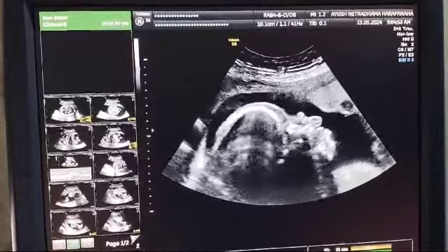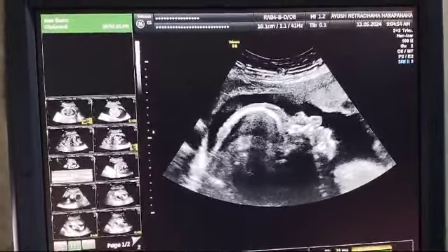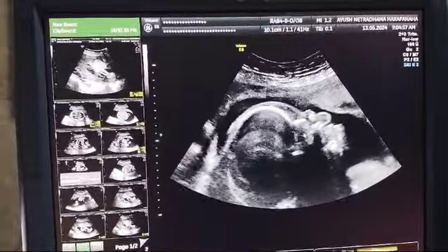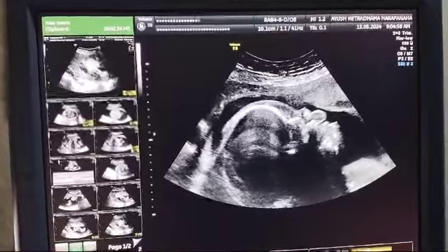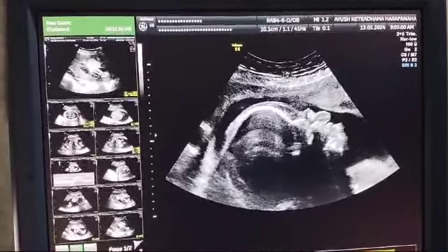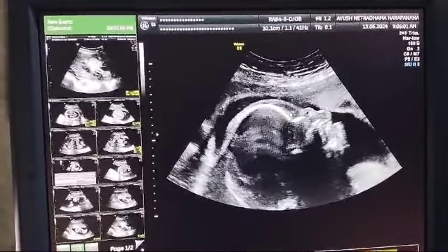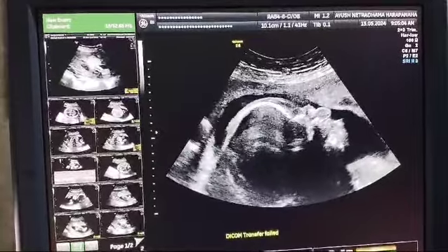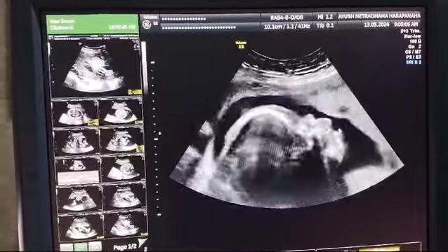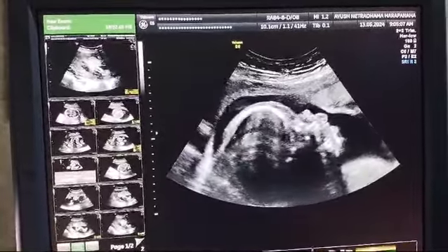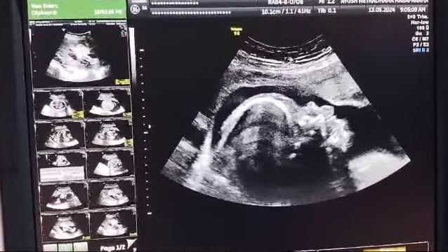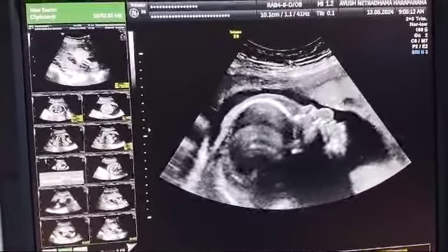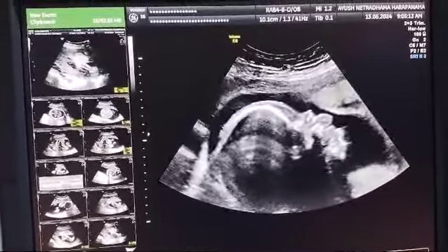This is a 25-week gestation. We are seeing a mid-sagittal facial profile. You can see that the frontal bone is bossing, and you can also see that there is a protruded tongue. The upper lip and lower lip appear to be thicker, and the soft tissue of the nose also appears to be mildly thicker.